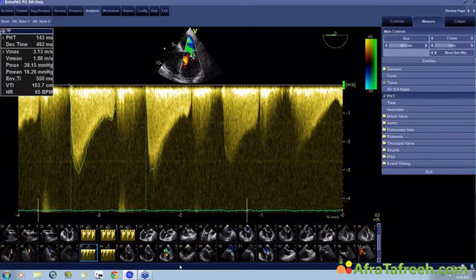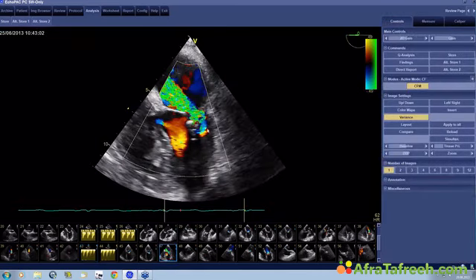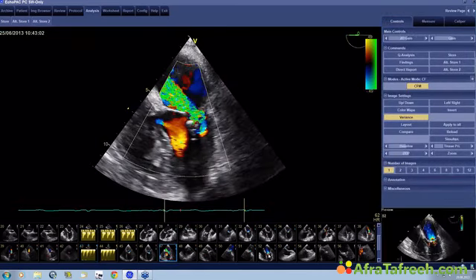The thing is that now we have more volume passing through the mitral valve, and this causes higher gradients simply because of mitral regurgitation. Remember, the blood goes back and forth between the left atrium and the left ventricle. Look at this massive MR we have now.